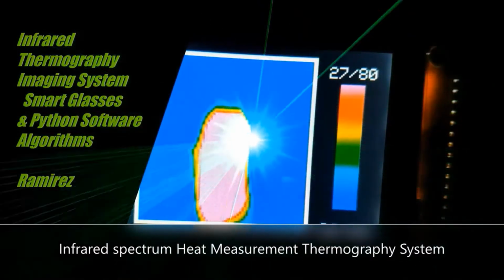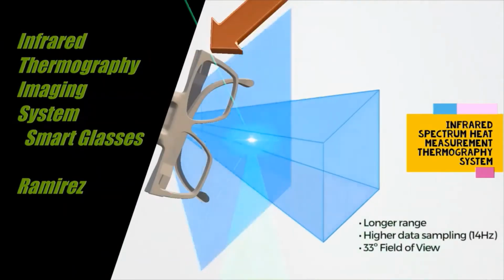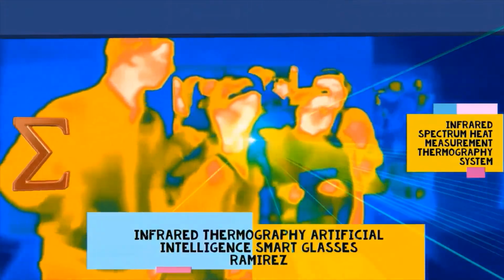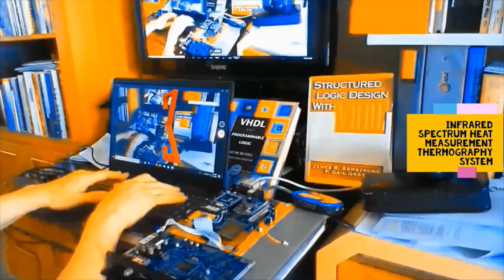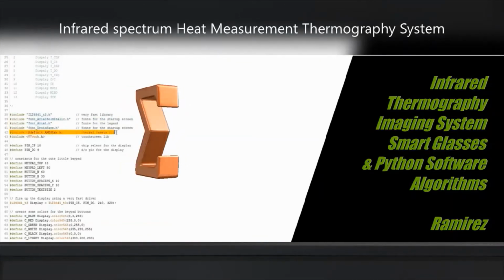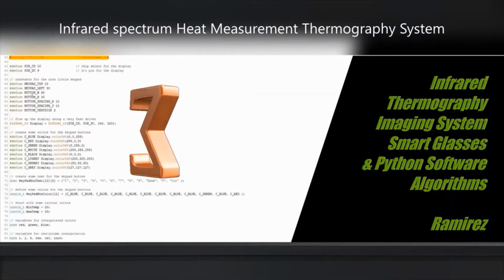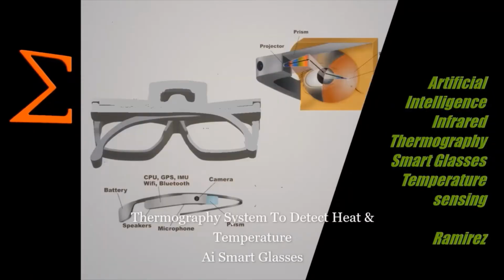Each pixel itself is a microbolometer with a size of 12 by 12 up to 35 by 35 micrometers square. These 150 nanometer thick thermal receivers are heated by the thermal radiation within 10 milliseconds by around a fifth of the temperature difference between the object and its own temperature.